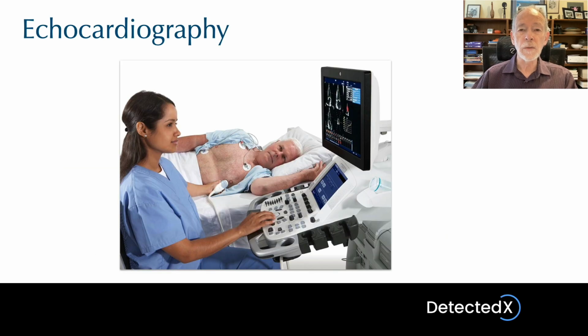At the other end of the scale, we have a very sophisticated echocardiography machine. This will also have continuous wave Doppler incorporated into it. The reason for this is that CW Doppler is able to detect extremely high velocities, such as occur in the heart when you have severe pathology. Later we'll see that pulsed Doppler is incapable of doing that.